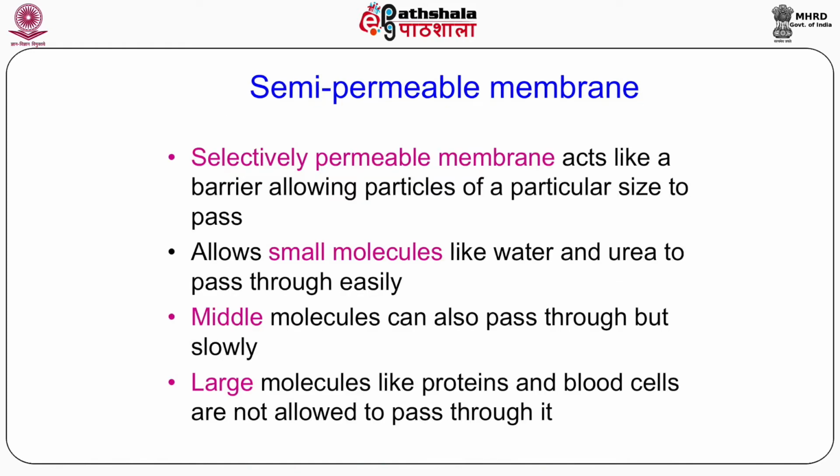Now we'll discuss the second concept, which is very important for understanding the process of hemodialysis, which is the semi-permeable membrane. As the name suggests, this membrane is permeable to certain substances while impermeable to some other substances.